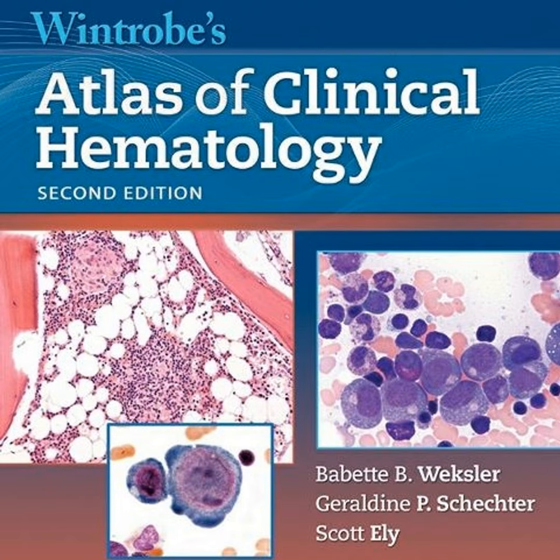Okay, imagine this scenario. A new patient presents, and their CBC report shows 2 critical findings: an MCV of 75 fL, so microcytic, and an RDW of 18.5%, which is very high. So small cells, but a big variation in their size. Exactly. And the person examining the peripheral smear notes microcytes, hypochromia, and numerous elongated pale RBCs, the classic pencil cells. So based solely on those morphologic and CBC findings we've discussed, the pencil cells, low MCV, high RDW, what is the most likely provisional diagnosis? And what single lab test is the gold standard for confirming it and telling it apart from its biggest mimic, thalassemia trait?